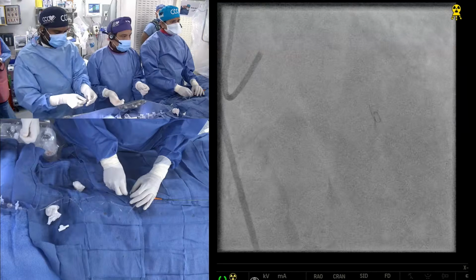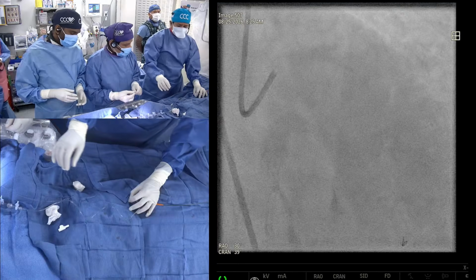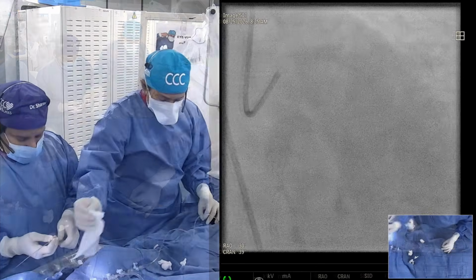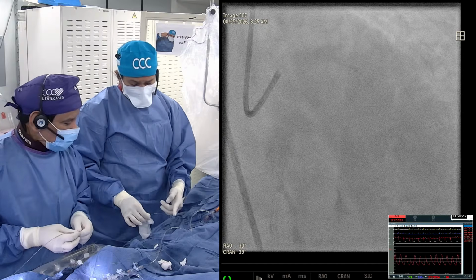So, I mean, interesting question here for you. Have you ever used OCT for a left main? Yeah, distal left main you can, here since it's a long left main, but ostial is usually hard because you need a lot of dye to see the dye clearance. Now you see this is kinked, rotor wire, and you will miss it. No, this will be okay.